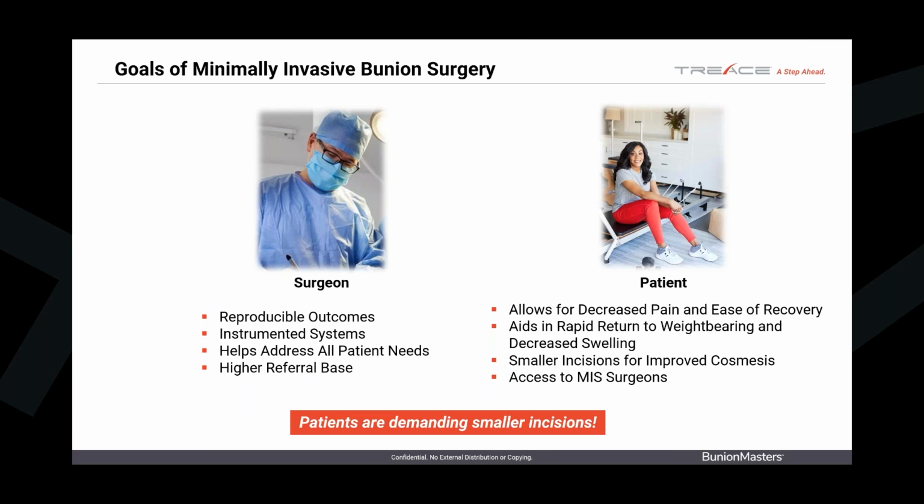It allows you to address all the patient needs of 3D correction, allows you to get the IM in alignment, allows you to get the sesamoids in alignment and correct the DMA. And we all know the big focus on the sesamoid position, the distal metatarsal angle and the hallux valgus angle are all important for us to reduce recurrence. And you'll get a high referral base, and the referral base is going to be from physicians. And trust me, you will have physicians in your hospital system asking you to do this on them, and they will be referring patients to you for life.